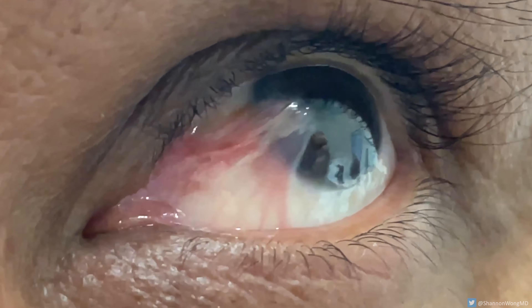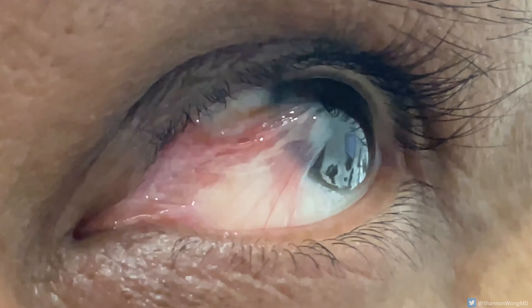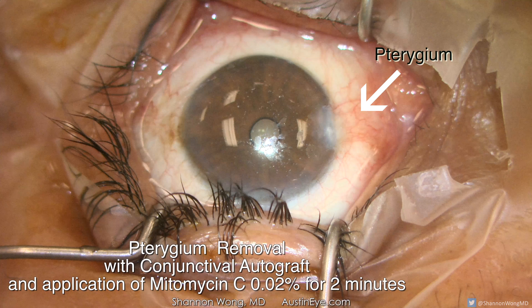There are a variety of techniques to remove pterygia. In fact, I'd venture to say that most surgeons have a slightly different technique.